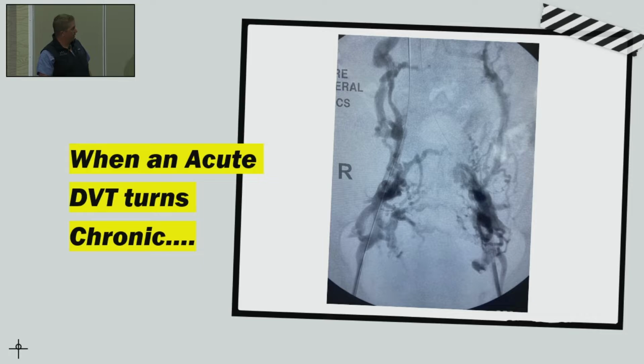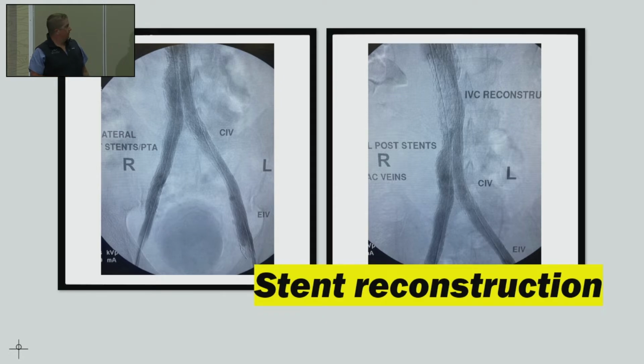Should be one contiguous amount of flow into the inferior vena cava. These are all collateral networks that have developed because the inferior vena cava and common iliac veins are chronically occluded. So we're able to cross it and then reconstructed him. And what's fascinating when you do something like this is what happened to all the collaterals. It's path of least resistance. It's a venous system. It's not hard, it's plumbing.